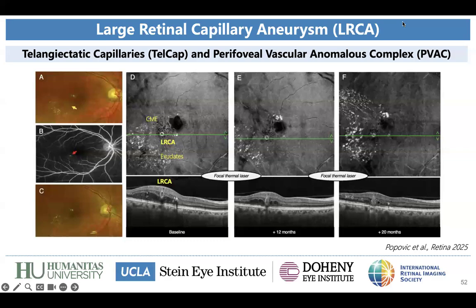Everyone has an opinion, but I don't have to do any other scanning or dyes, and I have this information. Totally agree, 100%. En face OCT for this type of aneurysmal lesion is truly the best in my opinion. You can actually visualize the lumen, the hyperreflective lumen, the ring, the distribution of the exudate, the distance from the fovea, which cannot be visualized so well by cross-sectional OCT.